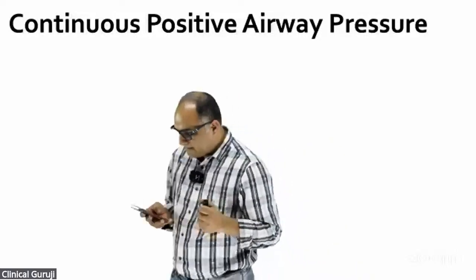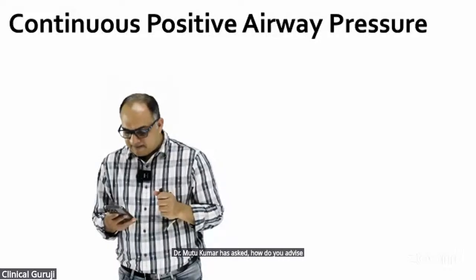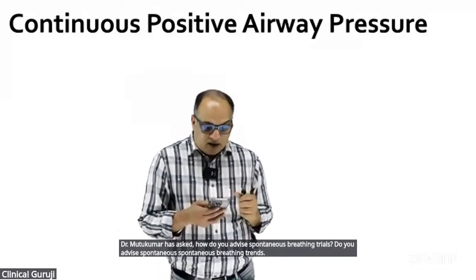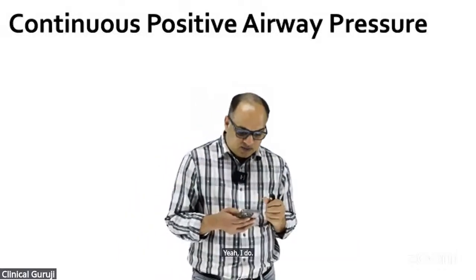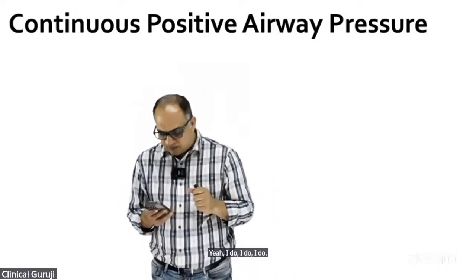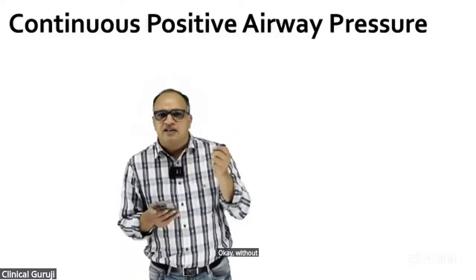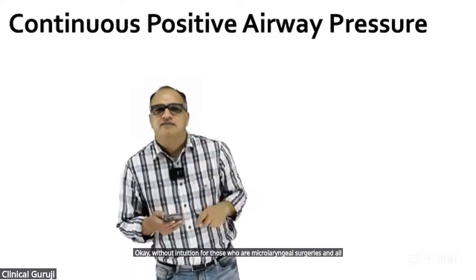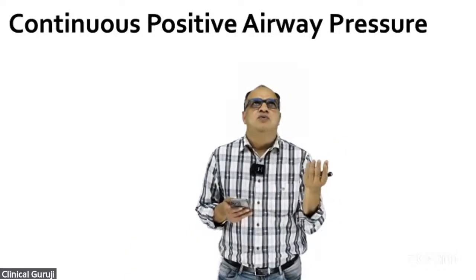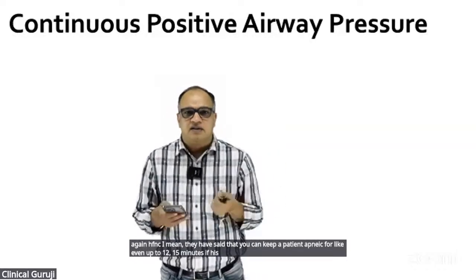So Dr. Muthukumar has asked, how do you advise spontaneous breathing trials? Do you advise spontaneous breathing trials? Yeah, I do. Okay, without intubation for those who have microlaryngeal surgeries and all, again HFNC. I mean, they have said that you can keep a patient apneic for even up to 12-15 minutes if his lung conditions are good.